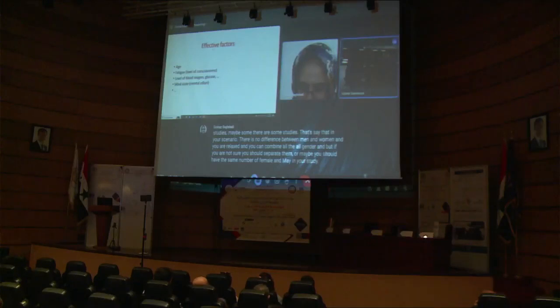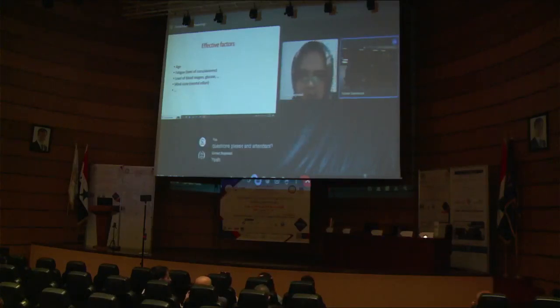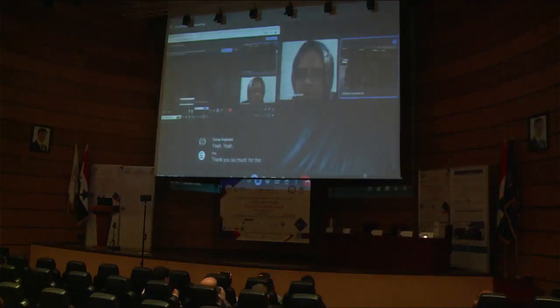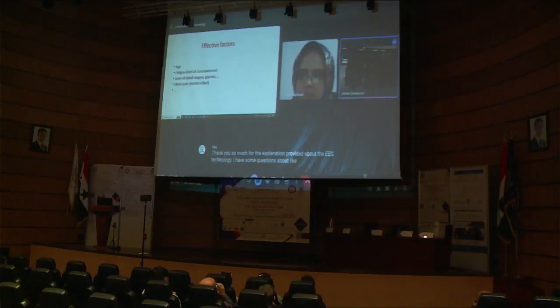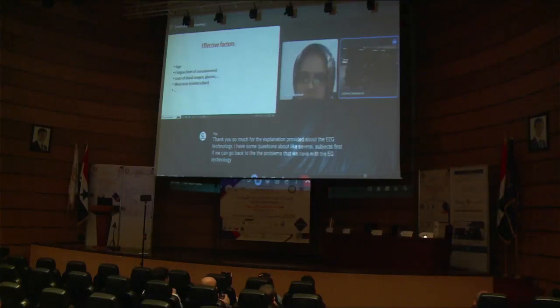A student has some questions, please. Thank you so much for the explanation provided about the EEG technology. I have some questions about several subjects. First, if we can go back to the problems that we have with the EEG technology, we can see the noise problem. Is there any way to eliminate noise?